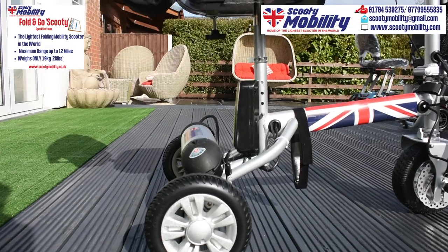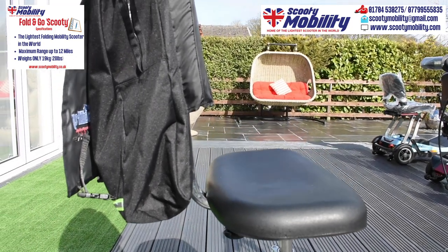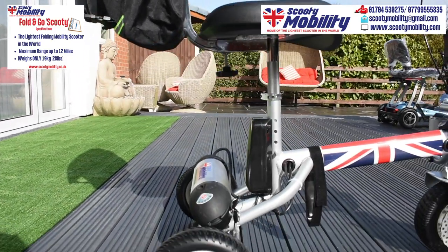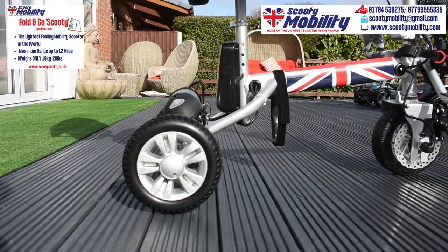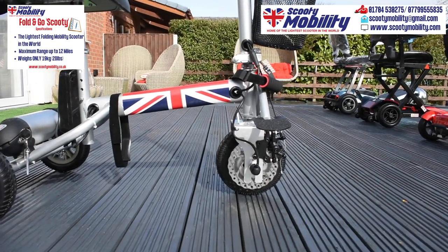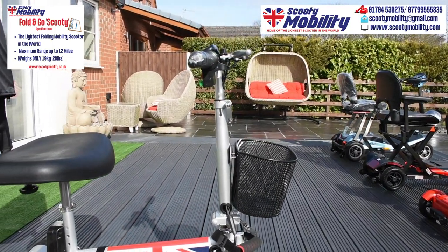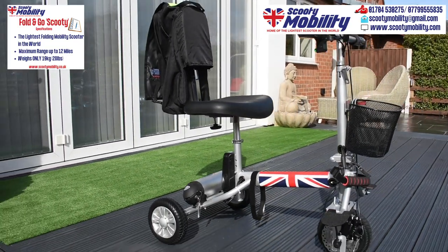So here we have the Fold and Go Scooty. This scooter is unique to us — British design. It has puncture proof tyres, so you're not going to get a puncture and be stranded somewhere, and a front disc brake. The brakes are manual, not automatic on this scooter — we have to keep the weight down, so that's something we removed. The brakes are operated the same way as a bicycle, with a handle on the handlebars.